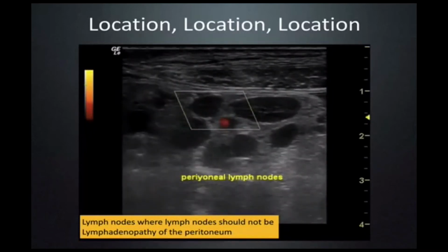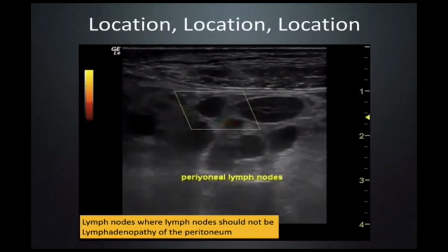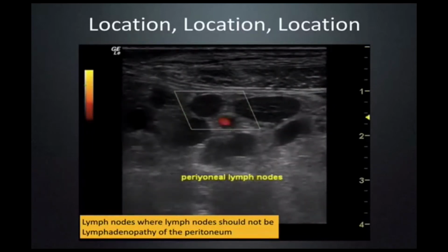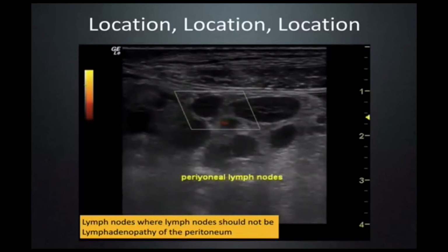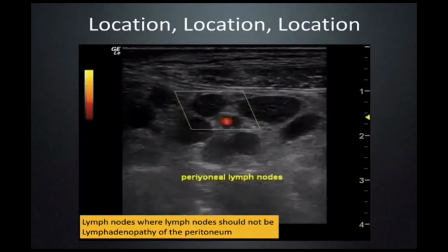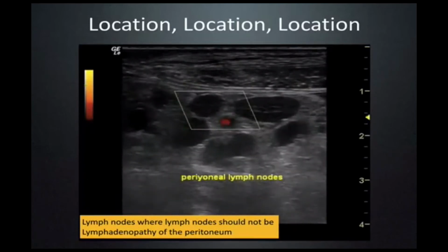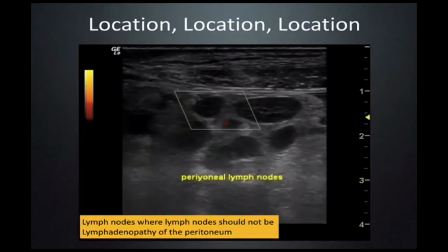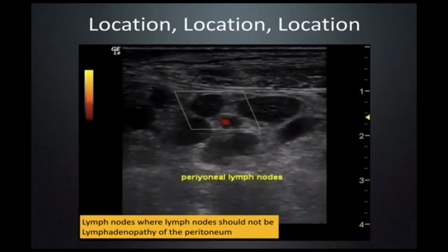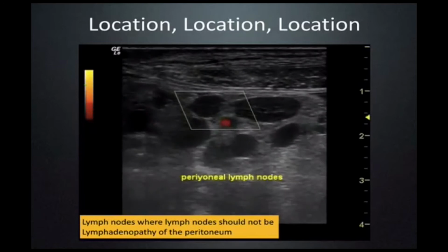This is an extremely thin patient, actually so thin that I would call him cachectic, and you can see that there's almost no subcutaneous fat whatsoever. The two layers that are moving in the upper part of the video image are actually the two layers of the peritoneum. The Doppler is on the aorta, and the aorta is completely surrounded by these abnormal-looking lymph nodes. This is a patient that I suspected of having disseminated tuberculosis.